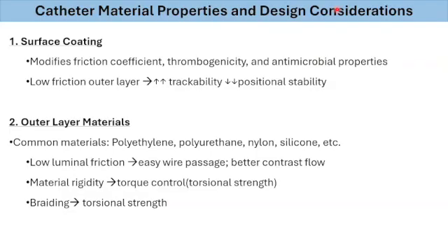Coming to the properties, surface coating of the catheter. So, coating of the catheters. One basic rule one of my friends told me was, all black catheters are coated and all blue catheters are not coated catheters. Coated means hydrophilic coating. And most of the hydrophilic coated catheters have a transparent hub so that you can see, and most of the non-hydrophilic coated have an opaque hub.